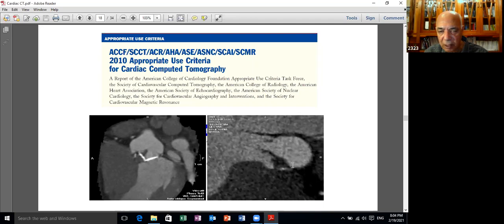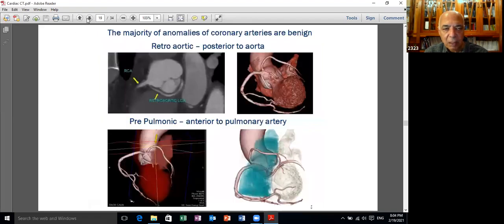Of course, the history of the patient, history taking, is paramount in these conditions, and you'll find here a filling defect, which indicates the presence of a vegetation, which was not seen by transesophageal echocardiogram. So you can use it in certain situations, which is non-coronary.